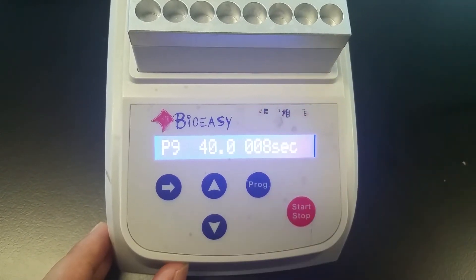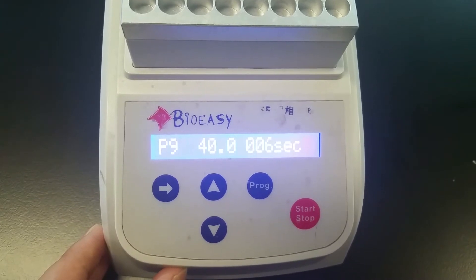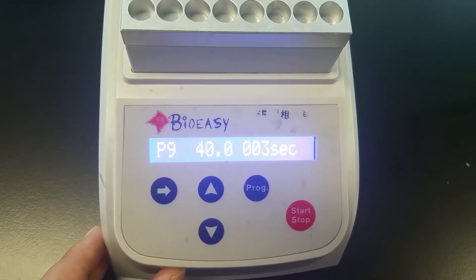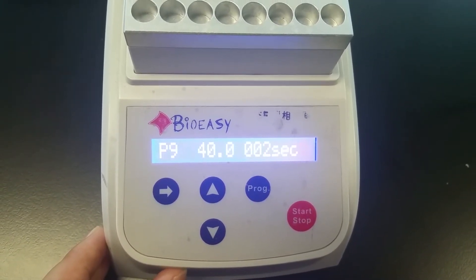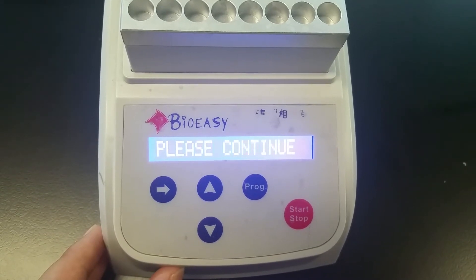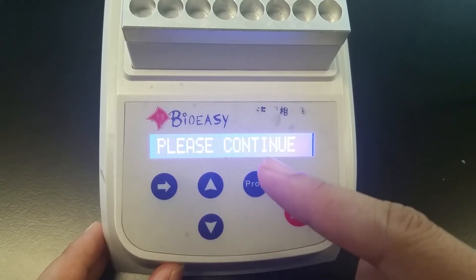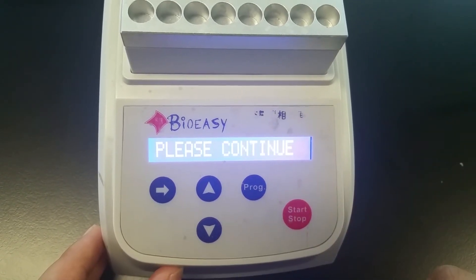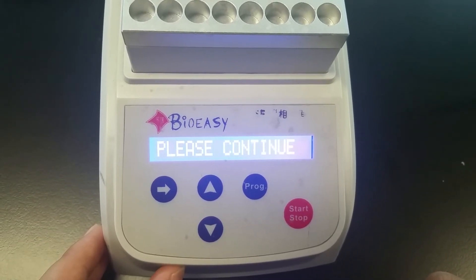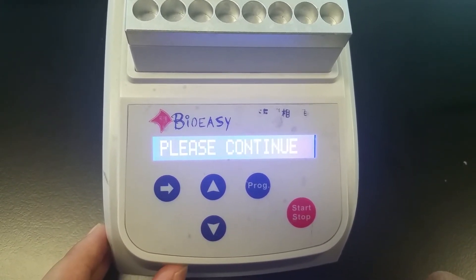Now it's 9 seconds, 8 seconds. After the first incubation, it will show: Please continue. After you insert the strips, everything is ready.